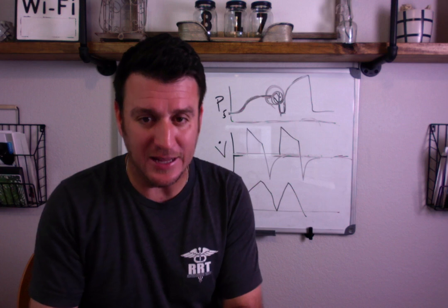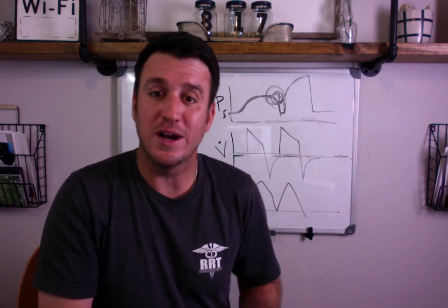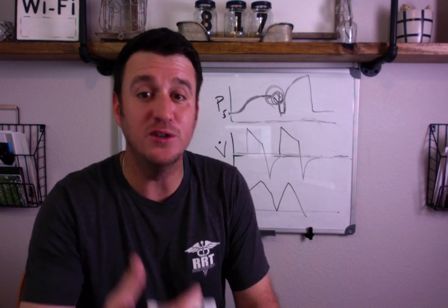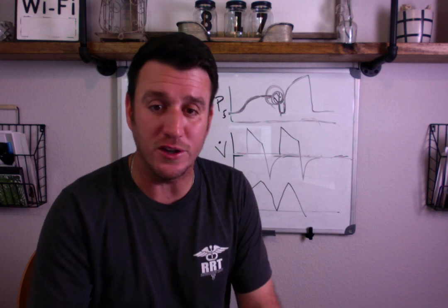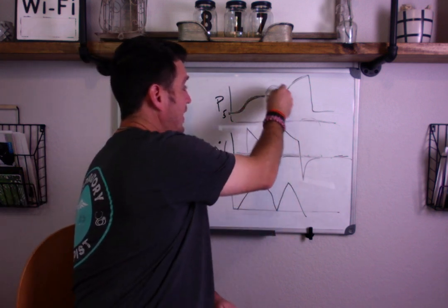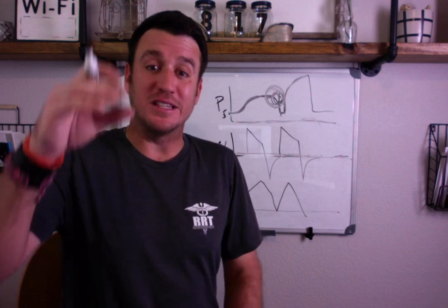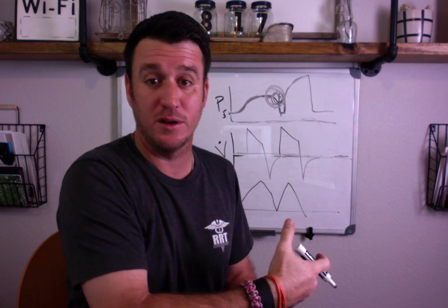Here in 2019, we're doing an average of 6 mLs per kilo. Well, guess what? 6 mLs per kilo doesn't satisfy all your patients. So when you see this happening, what you're seeing is a patient that is volume hungry. And what they're doing is, at the end of the breath, their diaphragm is still dropping, and they're going, I want more breath. But the machine, the vent, says tidal volume delivered, cut off.